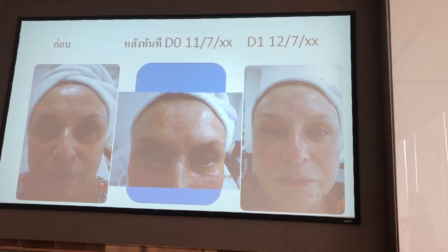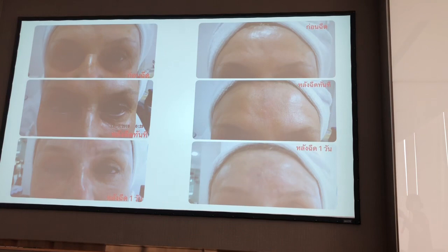You can see that immediately after the treatment, there is already some blanching, and it progressed. If you can detect this case at this phase, the result will be very good. But if you leave it longer, it's not okay. And you can see this one: before, immediately after, and 24 hours.